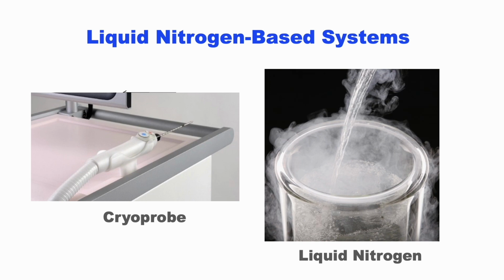So, although I said there's a limited volume that each ablation can achieve, as you'll see in a moment, you can combine multiple overlapping ablations to treat a larger volume of disease than you can treat with a single ablation.